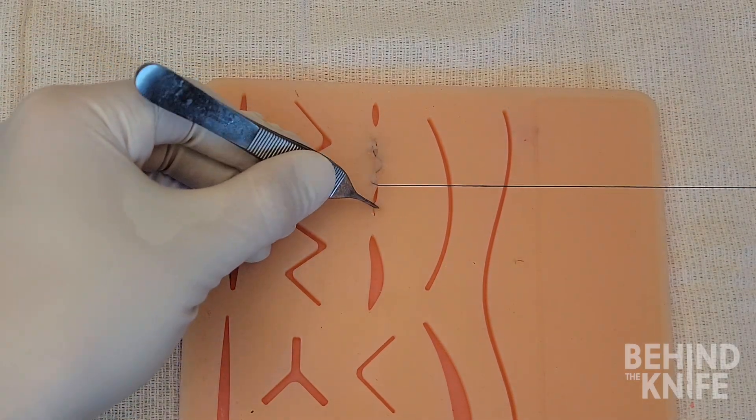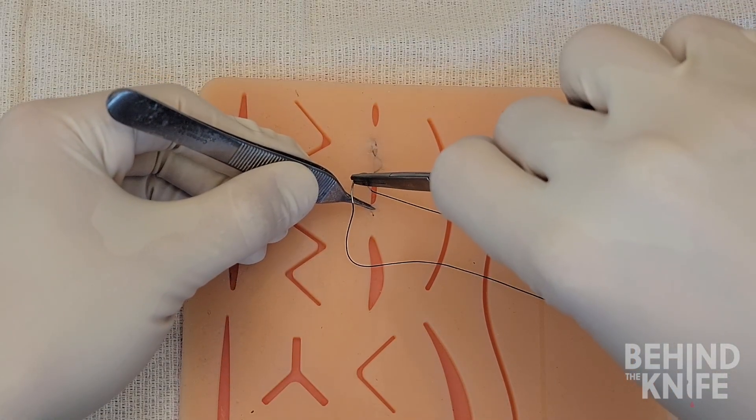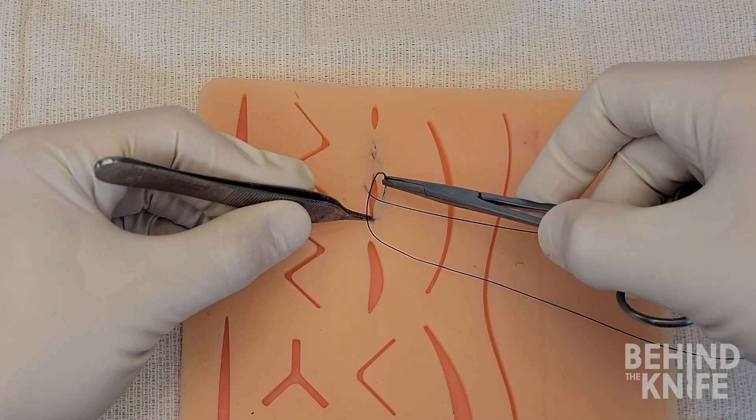As we advance our needle, be sure to take bites exactly perpendicular from each other to allow for the best tissue approximation.